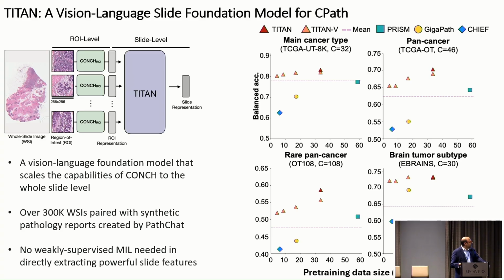And as our models are getting better, we're also trying to improve our benchmarks. So we had several of these benchmarks where the goal was not to get to clinical utility, but to see how difficult of a benchmark can we make where the model would begin to fail, right? So really difficult benchmarks like classifying multiple cancer types, but also looking at pan rare disease classification in hundreds of classes in a single model, and comparing how well this model would do in comparison to some of the other models. That's what we try to do, and then also assessing whether multimodal contrasting helps in this particular case.